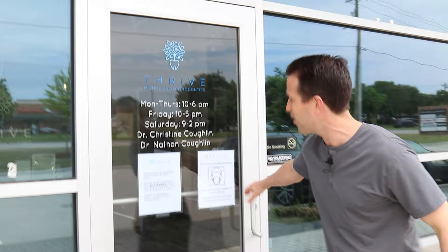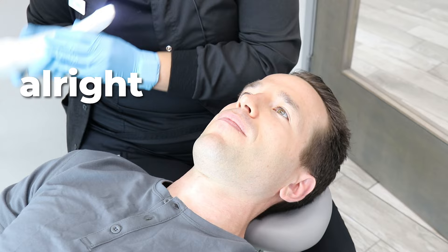We're going to go and see the iTero scanner — it is in a special room all by itself. We love it because it gives us such accurate results. Here it is — this is the iTero scanner. Malabi is going to help me out. It takes like a couple of minutes to scan you, and the results get sent to Invisalign within 10 to 15 minutes. You start the prescription, and then in four to six weeks we get the Invisalign trays back. Let's have Malabi scan me and see how it goes.